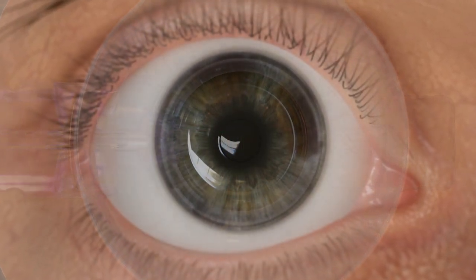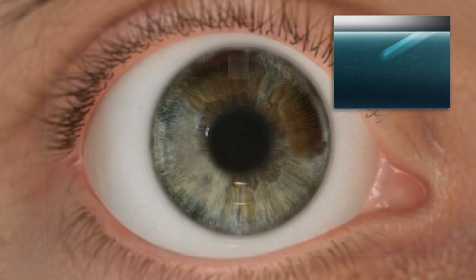The flap is created by first forming a tunnel to avoid an opaque bubble layer or OBL. The tunnel provides a path for the release of the gas and water generated in the flap creation process.